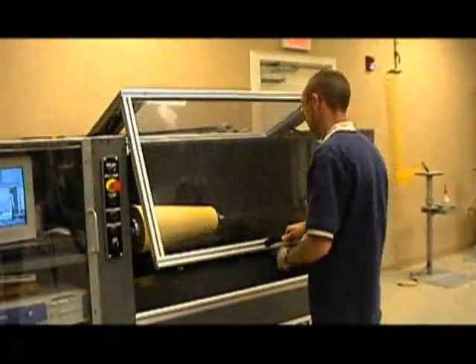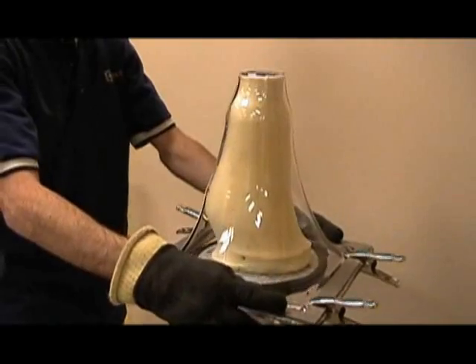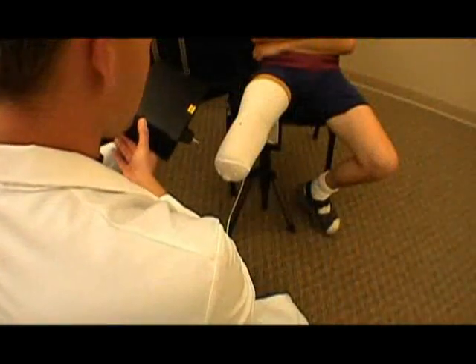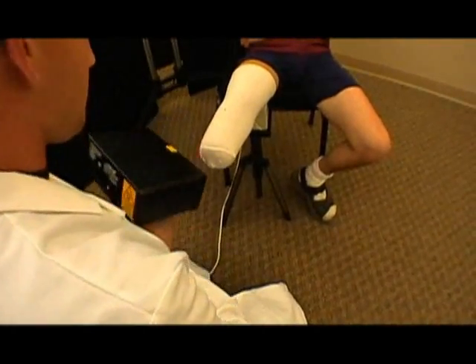We can do now in two days what used to take us two to three weeks. The reason for that is the technology that we use. We use a non-contact optical scanner to acquire the limb shape. It's very similar to what you see in the grocery store — when you pass through the aisle, they scan barcodes. It's the same type of non-threatening device.